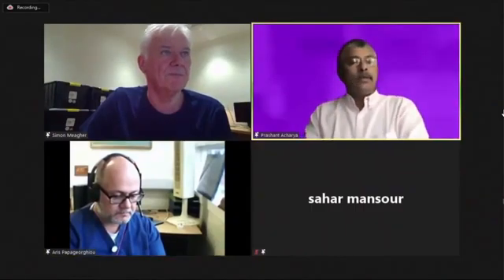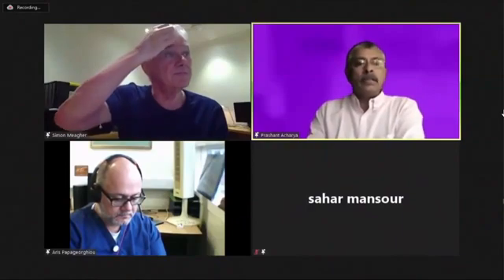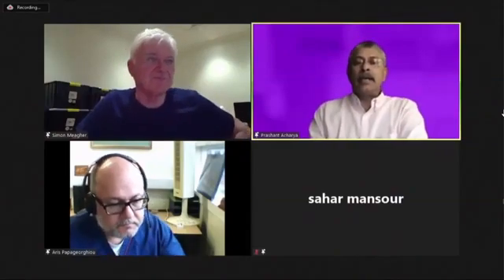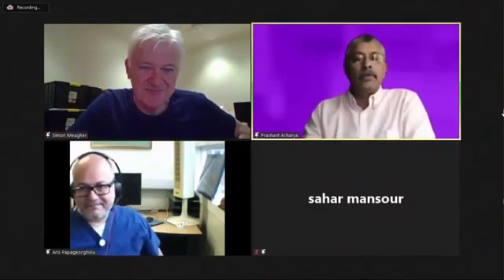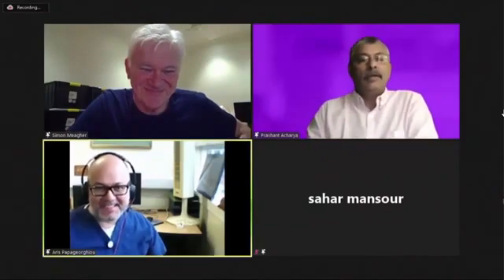Thank you, Aris. Now there is one more question from Romania. Madalena wants to ask, thank you for the presentation. At a 32-week pregnancy with an isolated short femur at 5th centile, what should I do? Question goes to Aris, of course. It's a summary of the whole program in some sense.